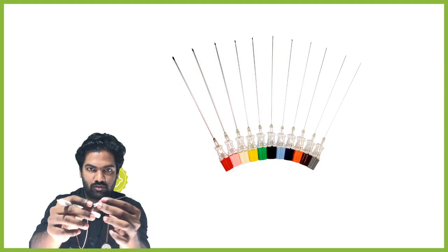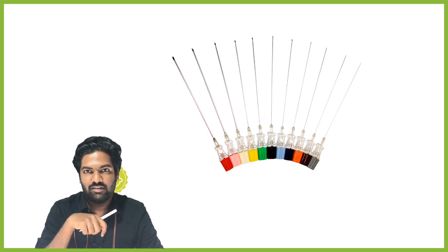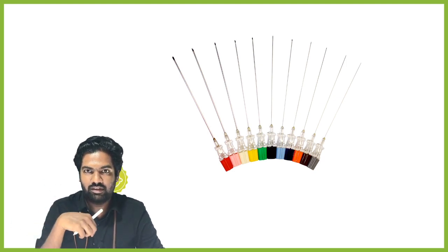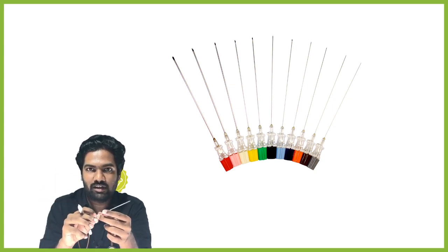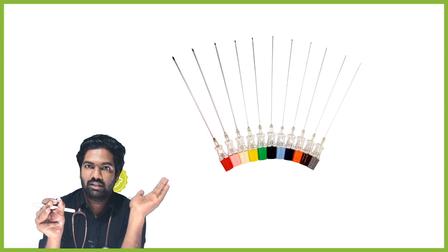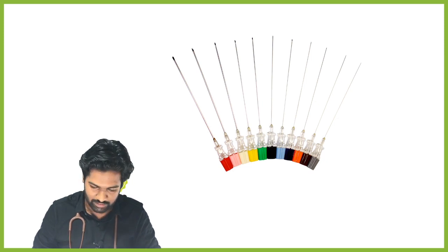So this is a spinal needle, and the luer lock. You can see here that there are multiple colors. Each color denotes a gauge. I told you earlier, when we were discussing French, that French was around one third of a millimeter. And here, as the gauge increases, if I say the gauge is 24, then the internal diameter decreases. Gauge means we are talking about internal diameter, French means we are talking about external diameter. These needles of different colors have different gauges.